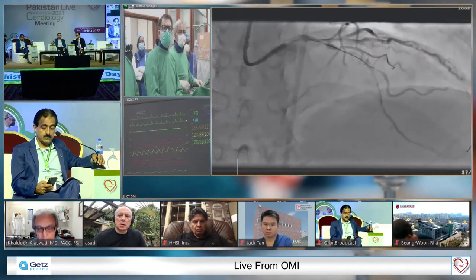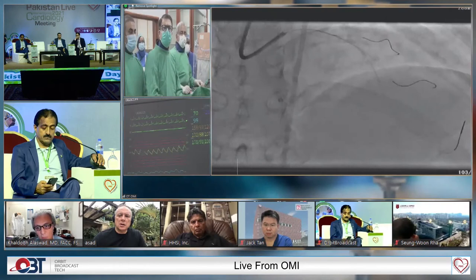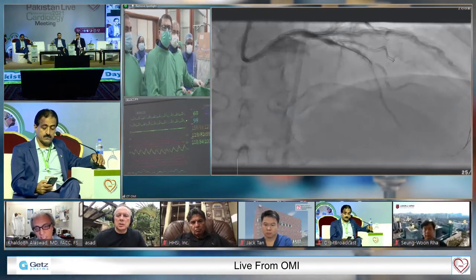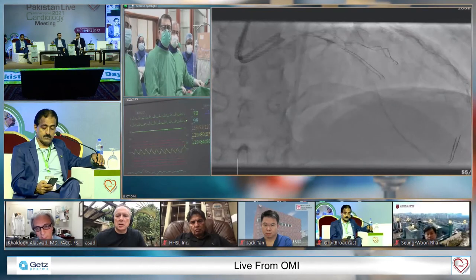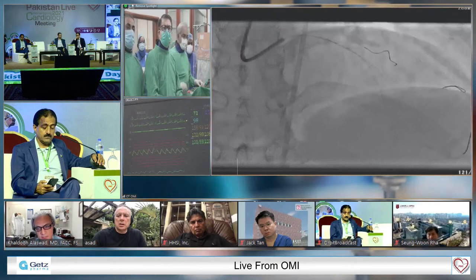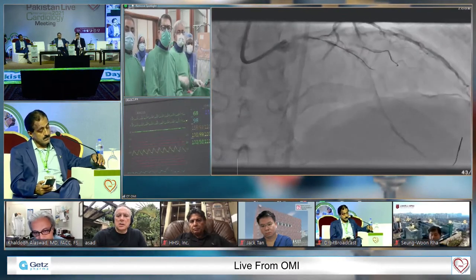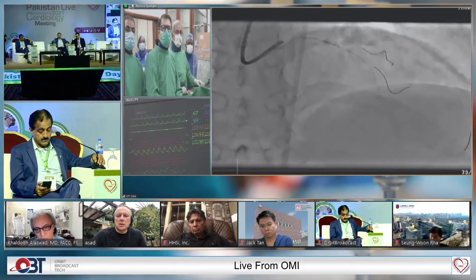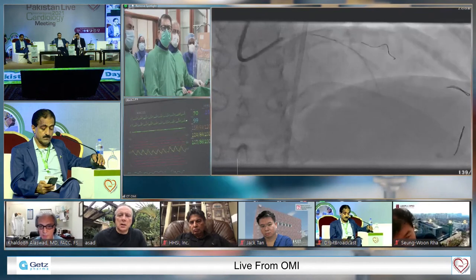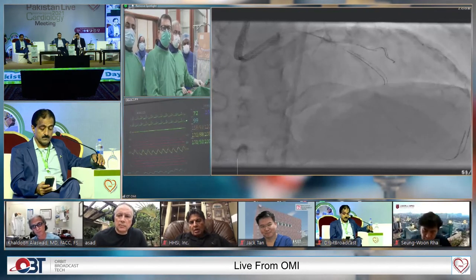The CTO-PCI is an expensive proposition. I normally try not to do so many complex things during a CTO-PCI. So if I can get away with a single stent strategy, I normally do single stent strategy, because the CTO-PCI is a device intensive procedure, so it becomes really break the bank if you do all these things. Even in America, we have to think about that.